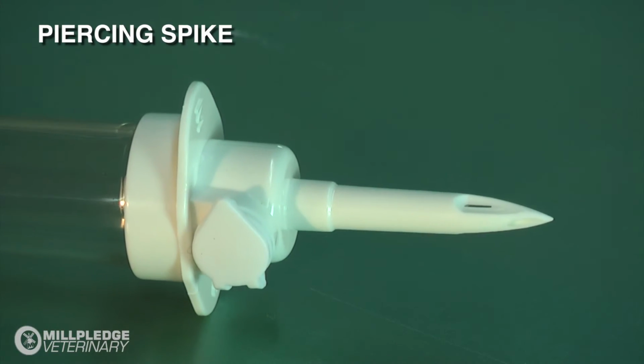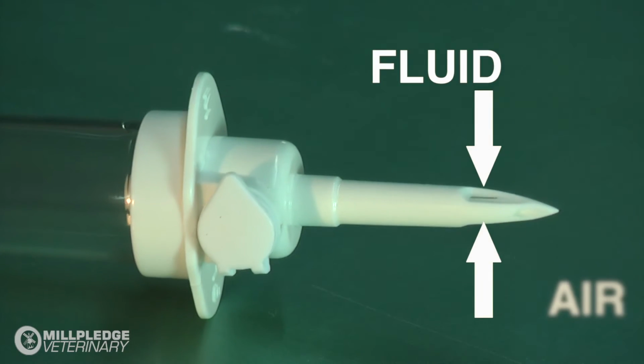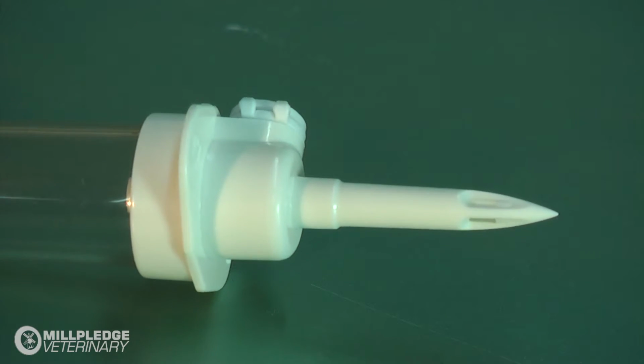We start with a piercing spike which has three vents. Two vents are for the fluid and one is for the air. This allows for rapid infusion when required and can prove to be more efficient.